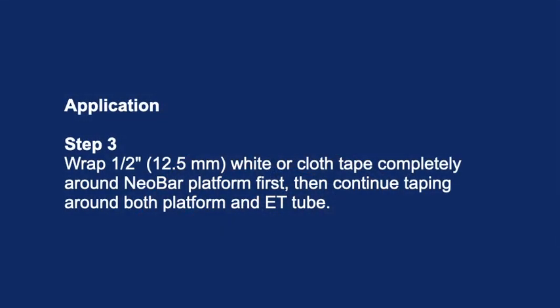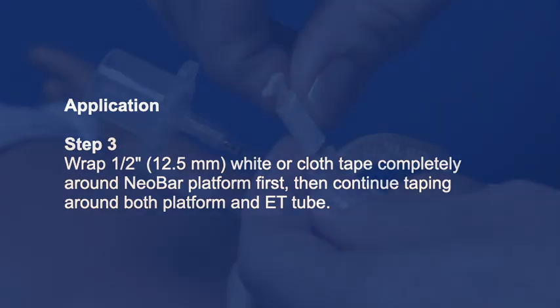Application step 3: Wrap half an inch (12.5 millimeters) of white or cloth tape completely around the NeoBar platform first, then continue taping around both the platform and the ET tube.